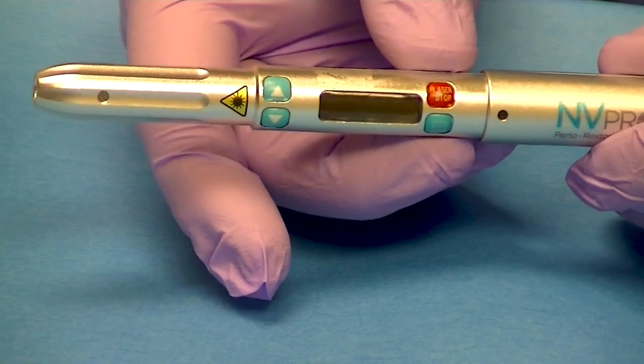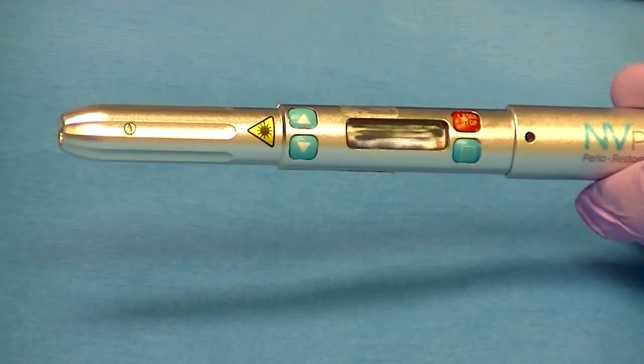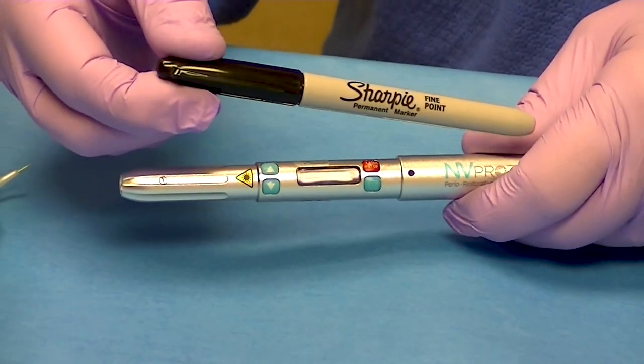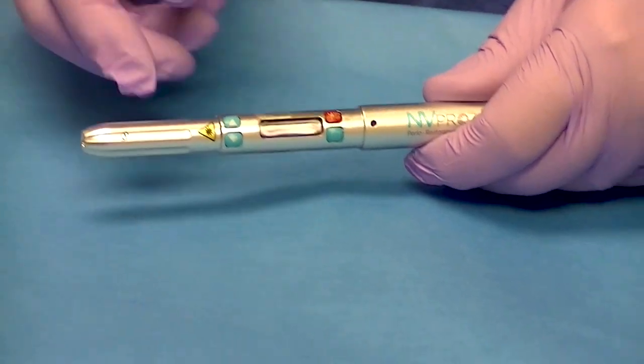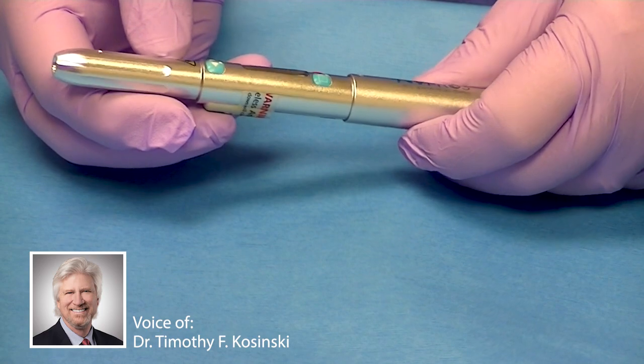The NVPro3 diode laser from DenMat is just a remarkable tool. You can see how small it is — it's almost a little bit bigger than a Sharpie, which is pretty amazing technology. It's wireless and very easy for us to transport from room to room.